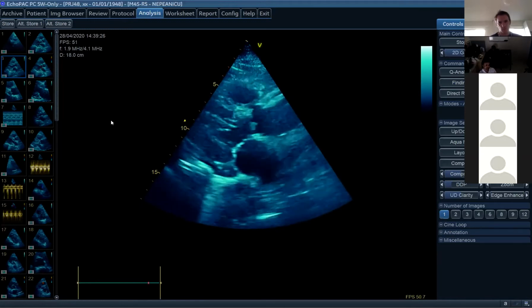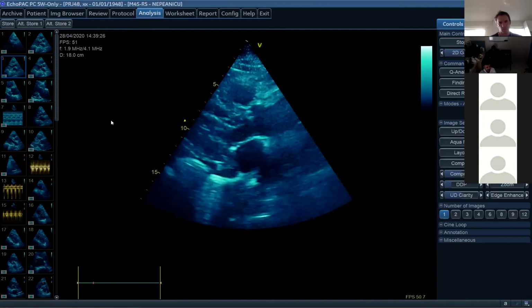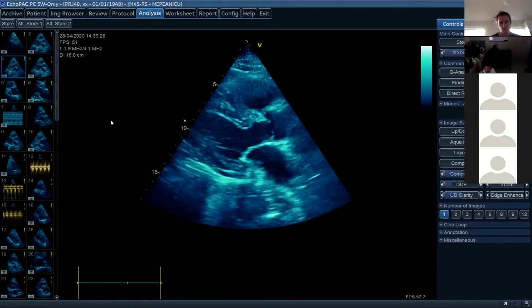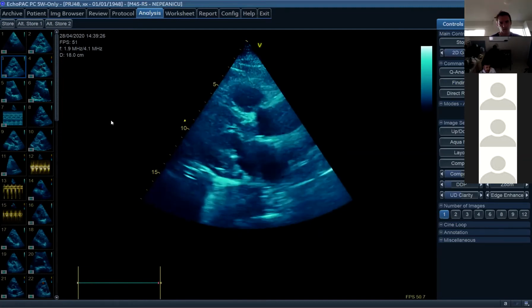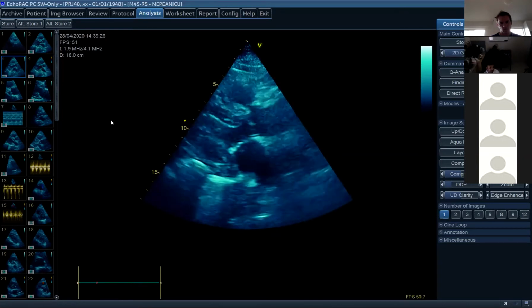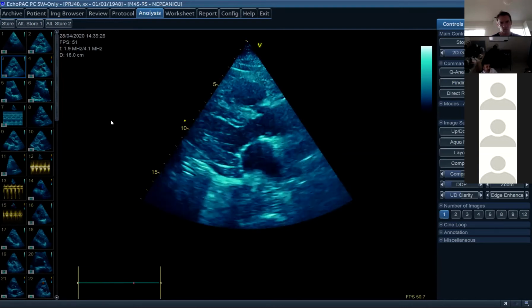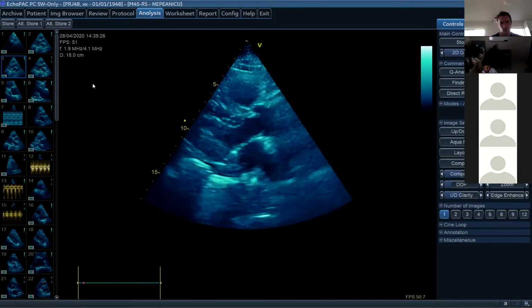So it's a parasternal long axis view. Nice. And from just visual, it looks like the septum is thickened and the posterior wall looks thickened, and it looks like kissing ventricles. Nice. What do you mean by that? So more likely to be hypovolemia as a cause of shock for this patient, or at least a contribution for this patient.